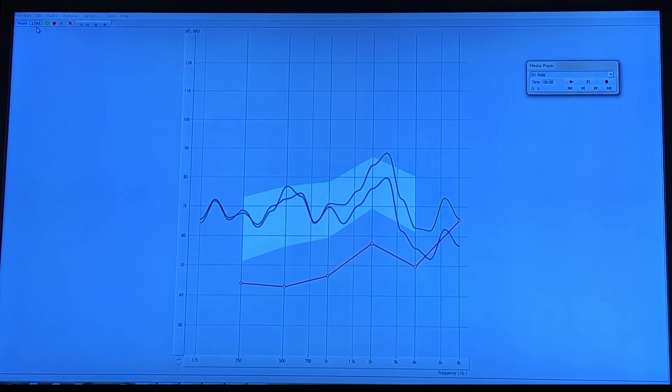I want to go in and make a few further adjustments. Some of it is also based on how it sounds to you as the patient. This doesn't look too bad at this point. And so again, this is a nice objective tool for us to measure what the hearing aid is doing while it's in your ear, without you having to do anything.